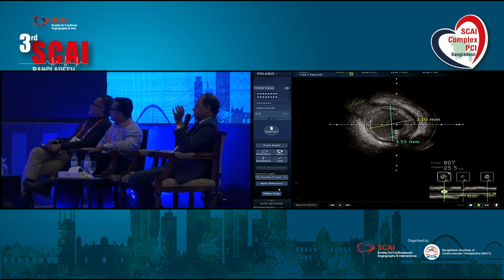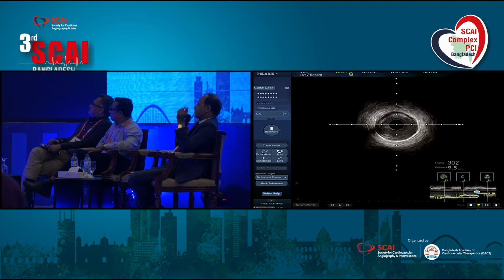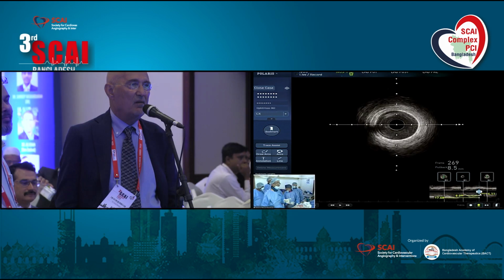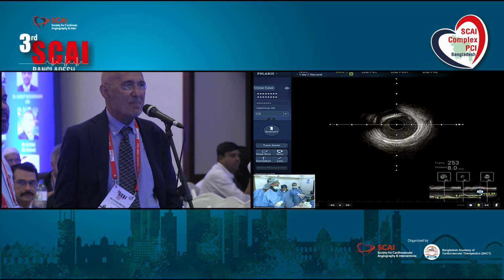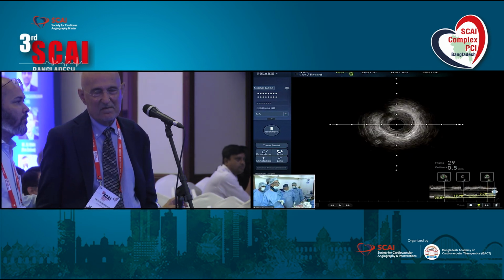On OCT we have, but not on IVUS. On OCT, I think a 270-degree arc of calcium, and the length of the dissection segment, I forgot, I think it is either 5 or 10 millimeters. Small and not complete, 270 degrees or less arc of dissection, you can leave it alone.